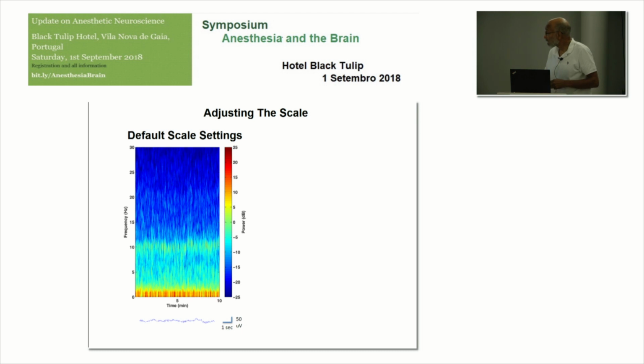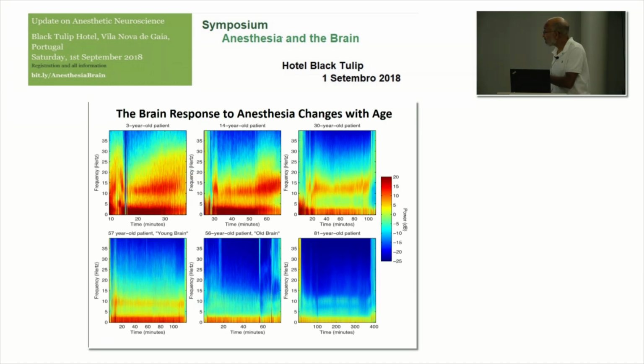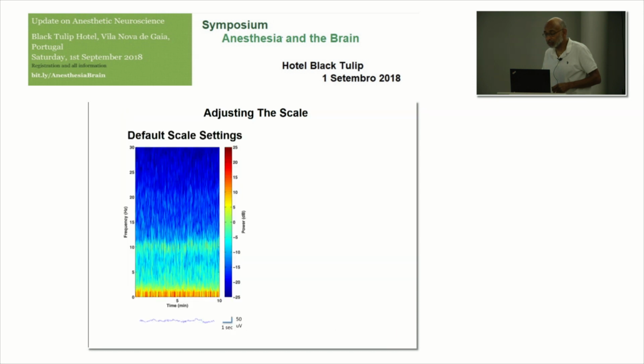And going back to this lady here, so she's 81 years of age. She had a tumor on her chest the size of an American football. It took the surgeons the better part of 6 hours to remove it. And she had an epidural in, and we were running a propofol infusion. And we're able to run the propofol infusion around 50 or so, as opposed to about 100 or 120. Because we're watching her EEG in real time, we're able to wake her up on a dime. So significantly reduce the dose of propofol needed to keep her unconscious, right?